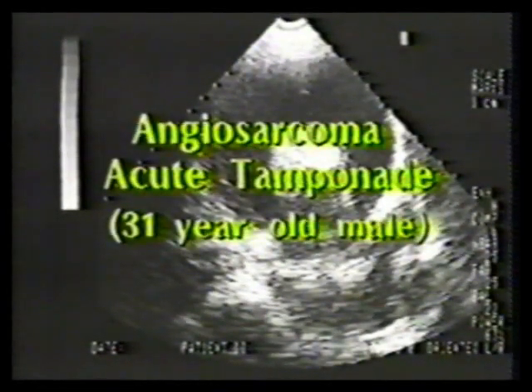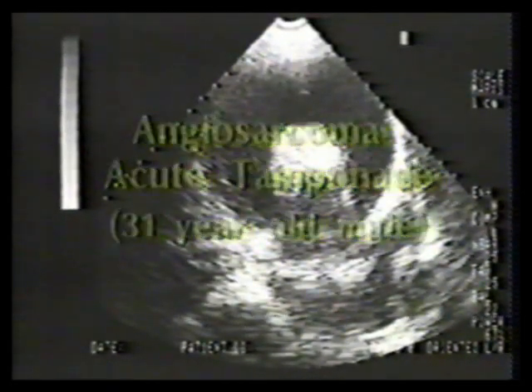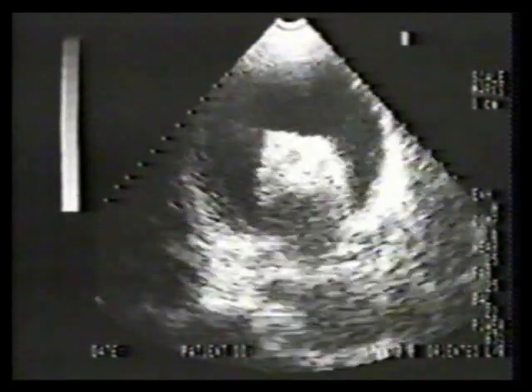The most commonly encountered primary malignancy of the heart is angiosarcoma. This is a 31-year-old male who presents with acute cardiac tamponade. The pericardial effusion was grossly bloody. Note that the swinging motion of the heart suggests cardiac tamponade. These tumors are usually found in the atrial wall and in the pericardium, and compromise the inflow portions of the ventricles.